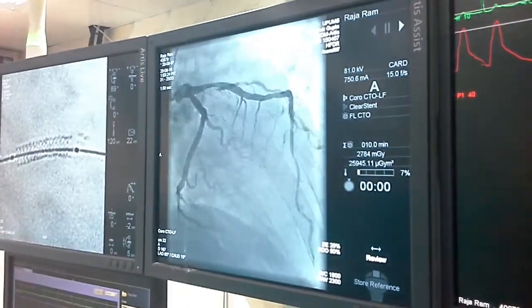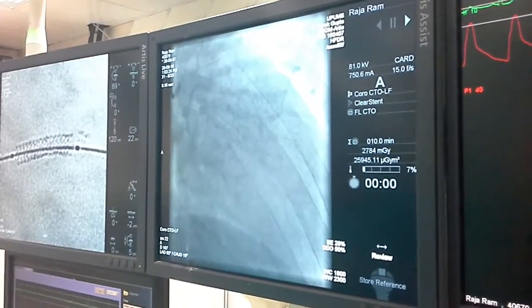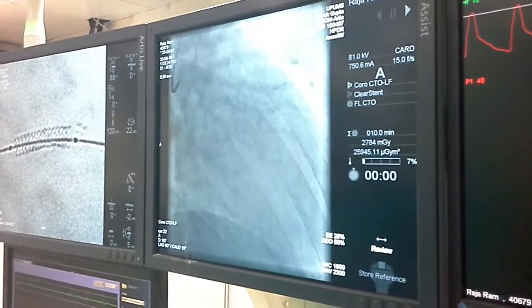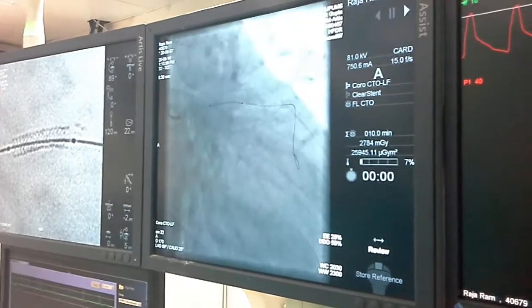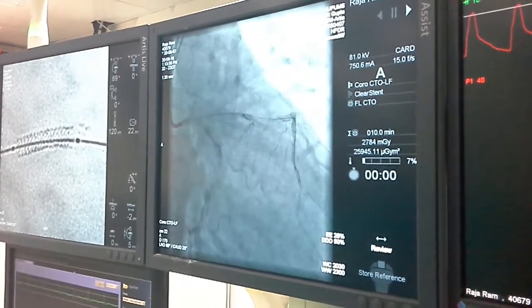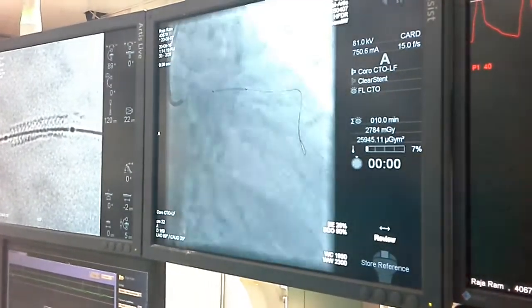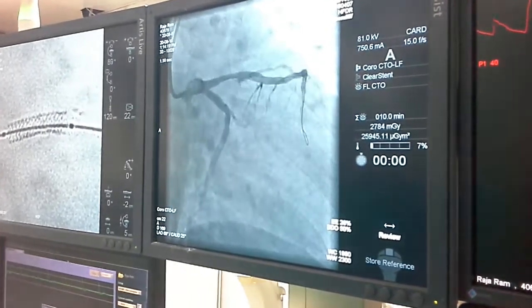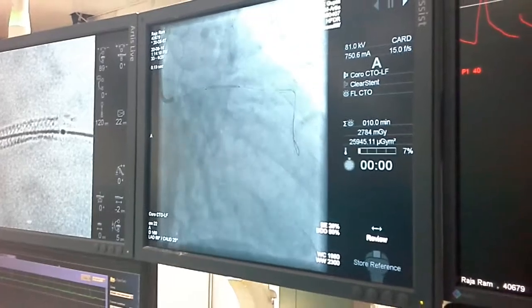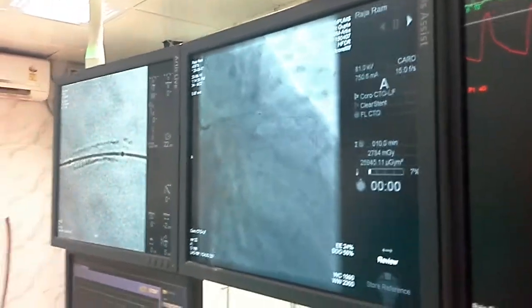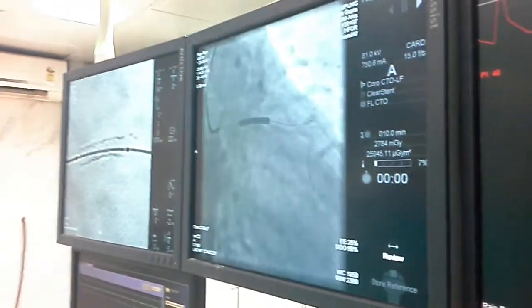We went up to 18 atmospheres for the 3.5 stent. The artery was reasonably big sized in the proximal segment, and the final result was perfectly alright with good flow.